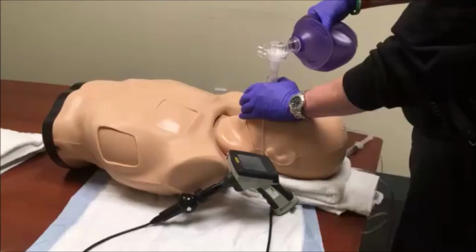We have a male patient, unconscious, breathing spontaneously but in impending respiratory failure. We need to secure his airway but will not be able to intubate using the oral route as his gag is intact and his teeth are clamped. We're currently assessing his ventilations via BVM, and we have nasopharyngeal airways in place on both nares.